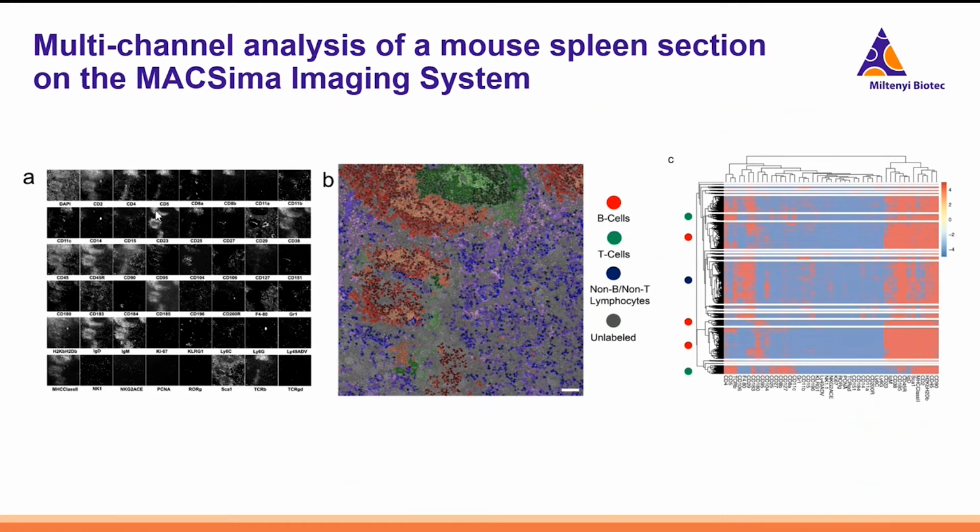Also, on the left, you see the colored dot, which indicates if a cluster consists mainly of cell types as classified here in B. I don't know whether you see my mouse, I'm pointing with the mouse, whether they consist of B cells, T cells, and so on. So the conclusion here was that the mixed technology can differentiate multiple cell populations in higher resolution and also provide the spatial distribution.